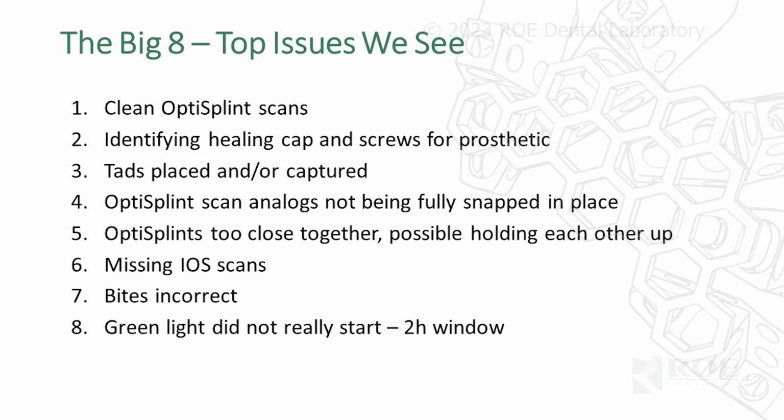And the prosthetic screws. We want to know what prosthetic screws you're using, right? Are you using the DES or the Vortex or the Dan Rosen, right? Pretty much those three. And I know there's a SIN. They also make one. Might be some others in the market coming around, but you have to tell us which one you're using. Otherwise, the screw channel is the wrong size. Okay, so that happens too.